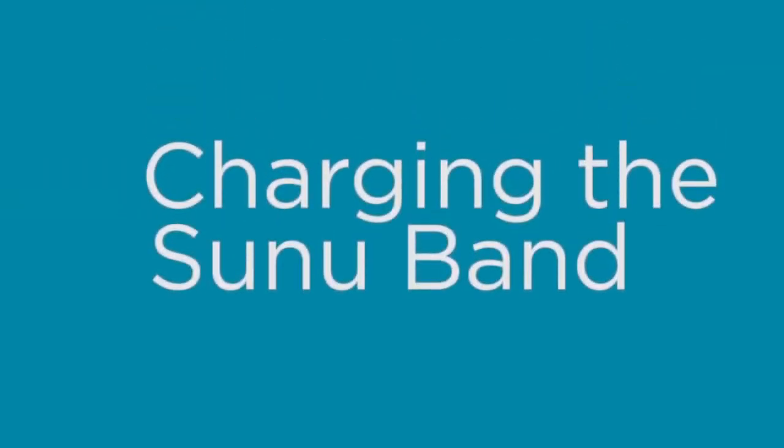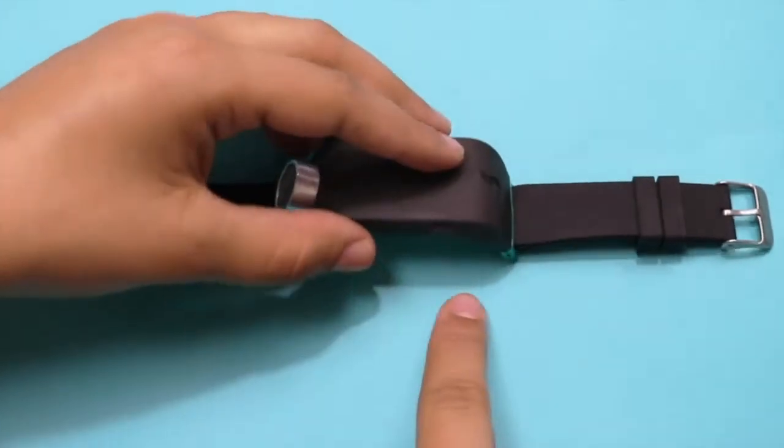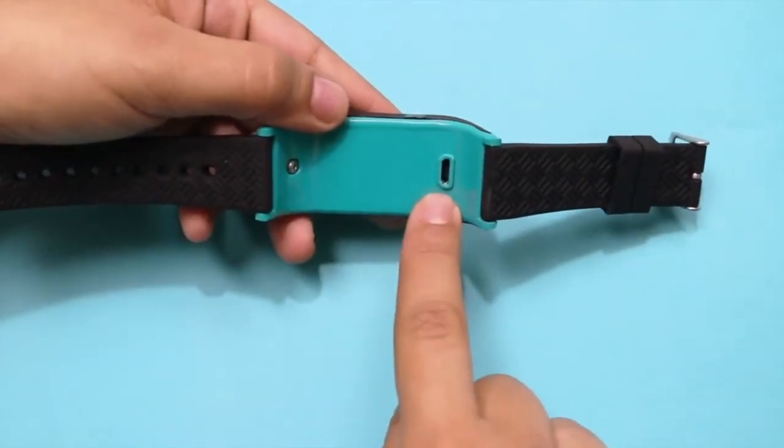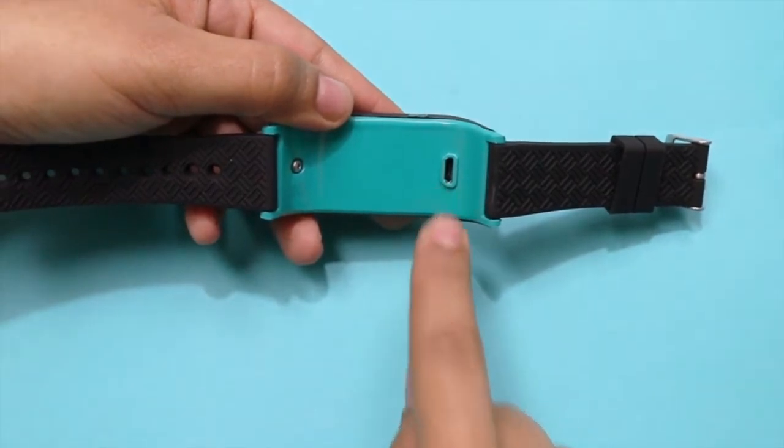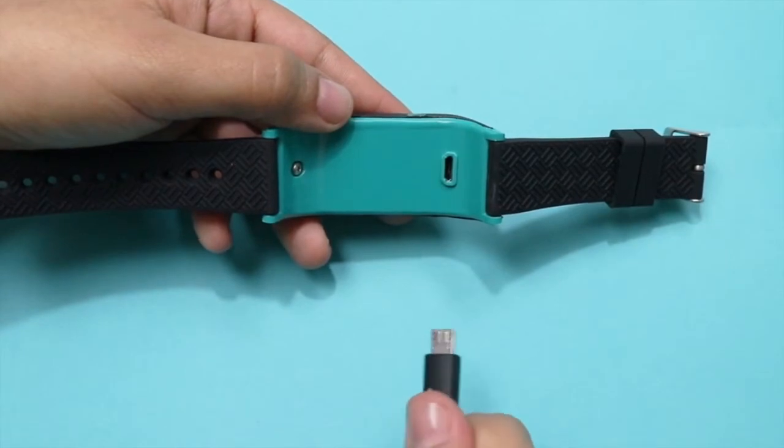Charging the Sunuban. Begin by identifying the micro USB inlet that's located on the bottom side of your device. Insert the cable into the connection slot until you feel a firm click.